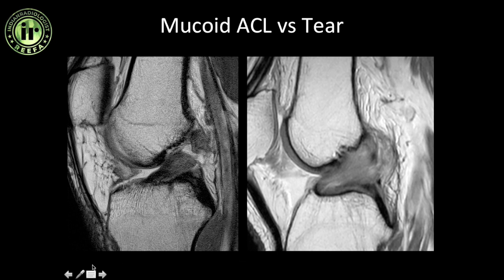Now how do you differentiate a mucoid ACL from an ACL tear? In an ACL tear, if you draw lines along the fibers you will see a complete disruption or discontinuity in the line, and there will be a fluid signal intensity in that region — which is the tear. In a mucoid ACL you can actually identify the fibers all along, so you will not see any disruption of these lines. The lines will appear more fuzzy but you can appreciate them very well.